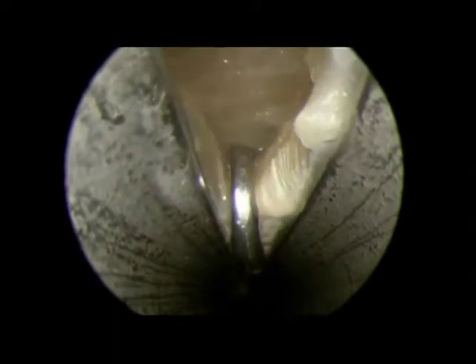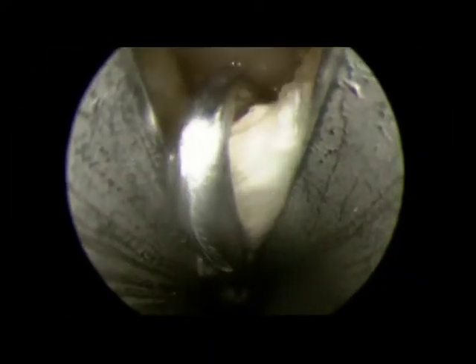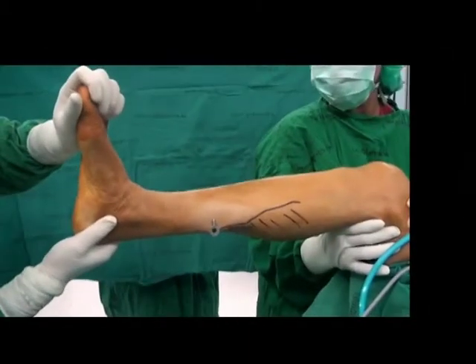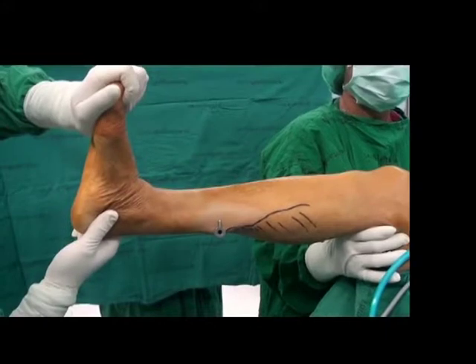This is due to the patient having long-standing equinus deformity. The fascia is cut completely from medial to midline, and all the way to lateral. After completely cutting the gastrocnemius fascia, we can observe the muscle by moving the ankle up and down. Ankle dorsiflexion is then measured and is approximately 10 degrees.